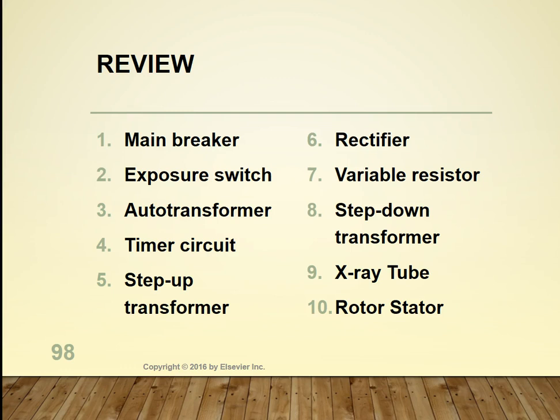Then we have the rectifier, a 4-diode rectification circuit, making the current go in only one direction. Then you have a filament circuit variable resistor. See, there's not that much in the secondary, okay? This variable resistor adjusts the current going to the filament, and it's going on at the same time because it's over here in the bottom of your image.